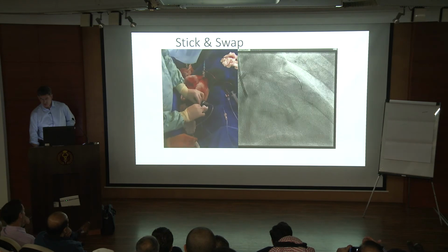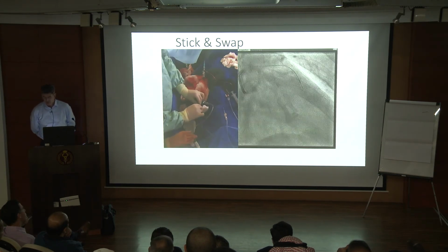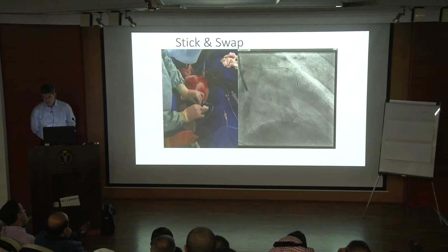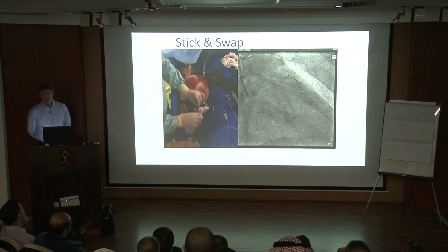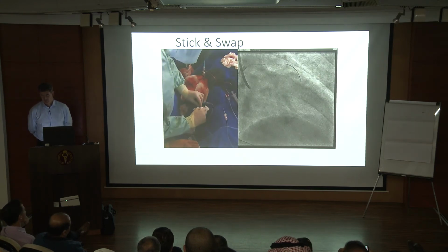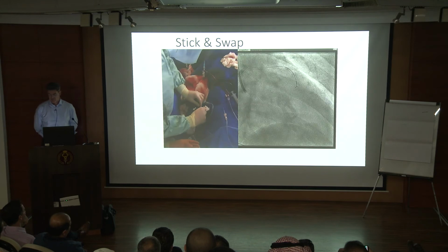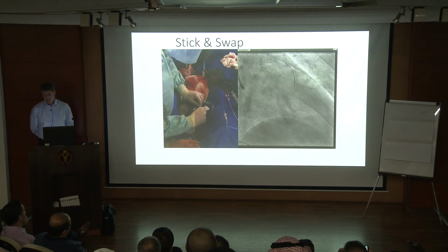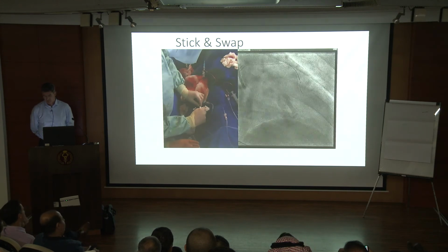This is the same case being done by Simon, and he's now come back, I think, with a Pilot 200, so putting a slightly more acute tip on the Pilot 200 just to try and engage this side port, and there we go. So exiting the side of the balloon, coming into the vessel, then turning round, and now we'll be advanced, and here we are going into the distal vessel.